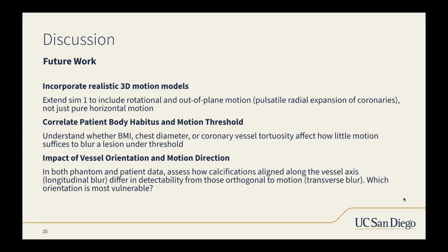For future work, there are so many things that we could add on to see what the confounding factors are with all of the different cases for motion blur. We thought it'd be interesting to incorporate realistic 3D motion models, to extend simulation one to include rotational and out of plane motion, like pulsatile radial expansion of the coronaries and not just pure horizontal motion.